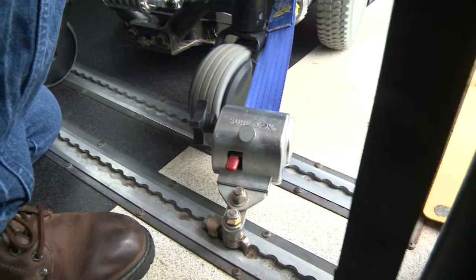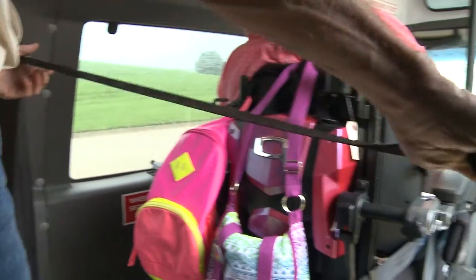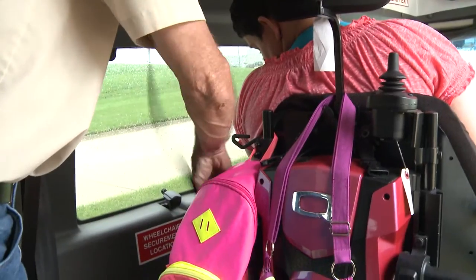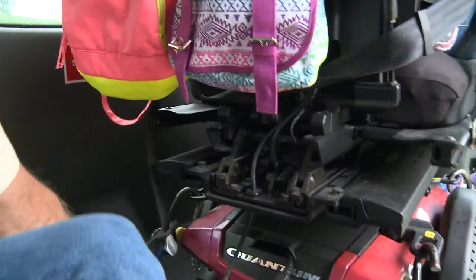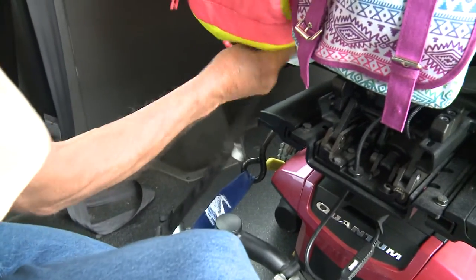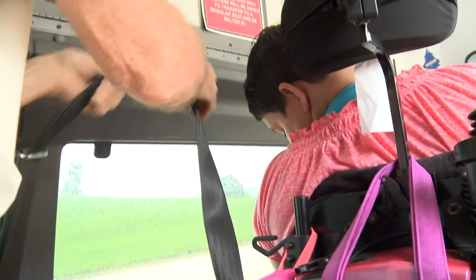We're going to do the occupant restraints. This particular occupant restraint is a two-piece belt component. Pull it out — we will drop this down the gap back behind her bags here. This will snap onto the pin connector on the retractor. The occupant restraint buckle will come up through here. Pull the webbing slowly.